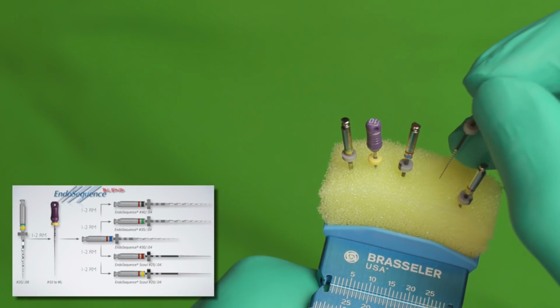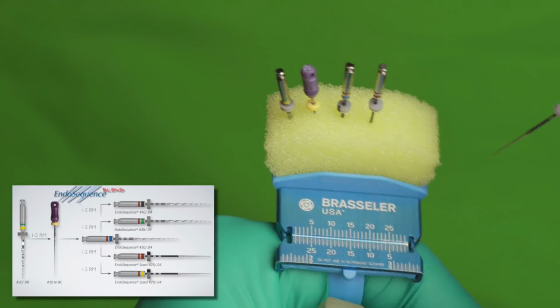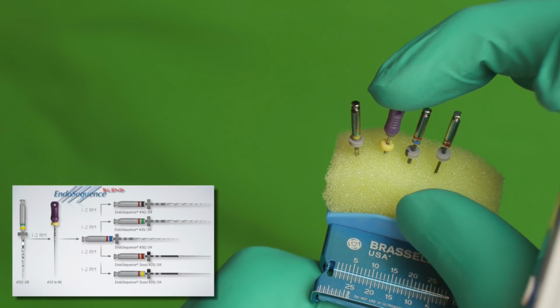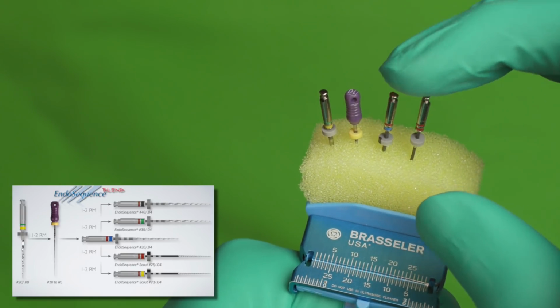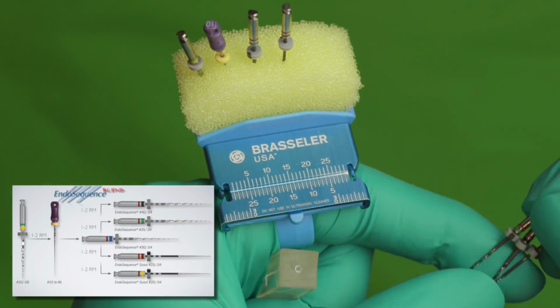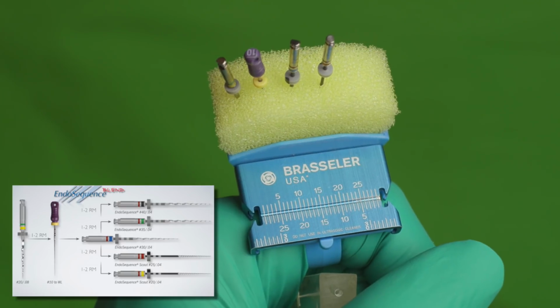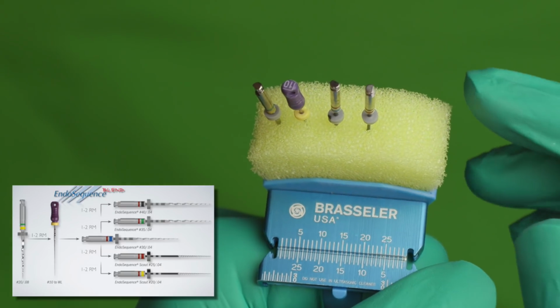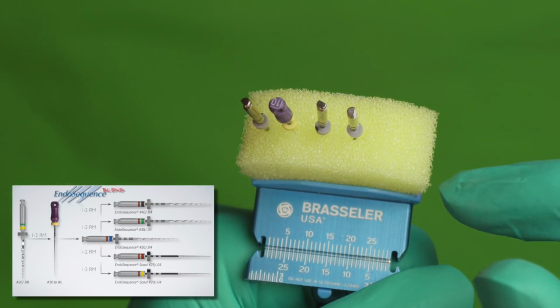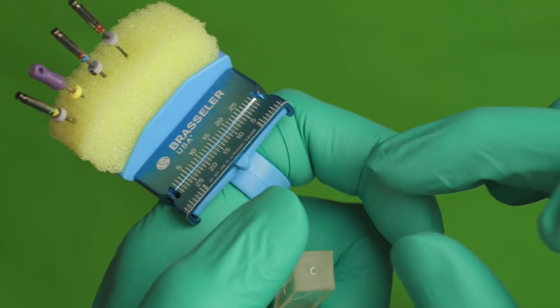In fact, in the hands-on with this block, you will see that you're able to do it even without the size 20. The orifice opener, a size 10 hand file, the size 30 EndoSequence, and the 25 scout is all that is needed to complete this block. So I'm going to put away these 3 files so that you don't get confused with them being on there. But know that clinically the protocol is that you're going to have to triage each canal that you're dealing with. This is not a universal protocol to use in all canals, but rather the one that is needed in this block.